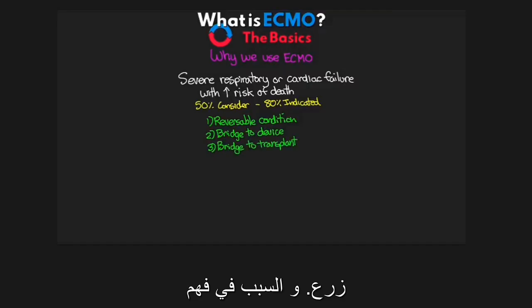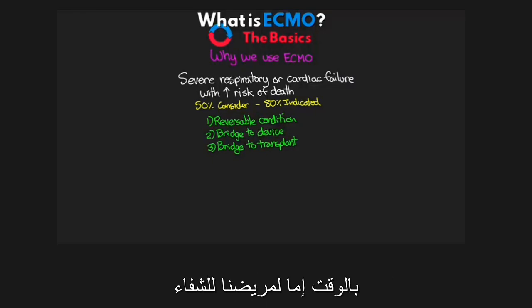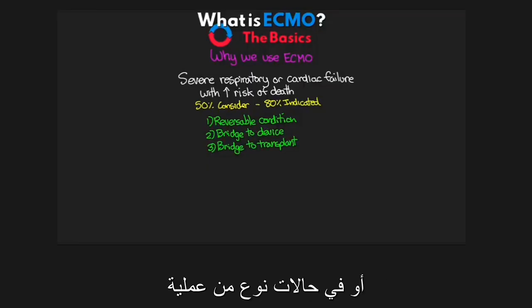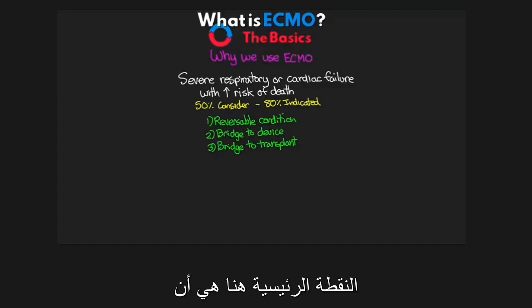And the reason to understand this and to really think about why, is because ECMO is not any sort of treatment. ECMO is not going to fix the underlying problem of whatever's going wrong with our patient. It's merely a form of life support that's going to allow us time either for our patient to heal naturally so that we can come off, or in the cases of a device or some sort of transplant, to buy us time in order to be able to either implant a device or to be able to get an organ transplant. So again, really key takeaway here, ECMO is not a treatment. It's not going to fix your patient.